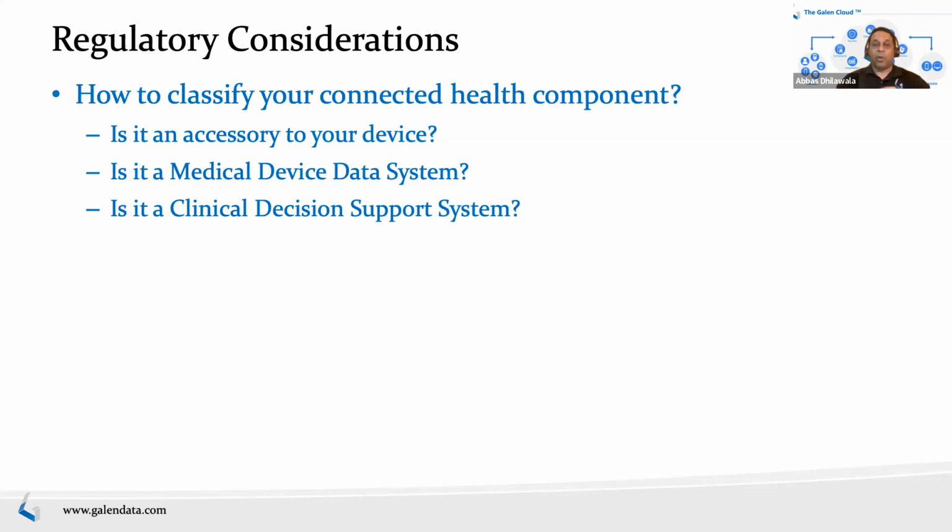Again, this is a regulatory question. I'm not going to go super deep into this, but these are questions you need to ask your regulatory people, and how do you deal with that? And that's why your ROI sometimes can come into play. Do you do it now upfront? Do you do it later once your device is approved? And what are the ramifications for those things? As I said, your digital component might not even be a device, not even fall under any kind of regulation. Unlikely, but that's possible. Again, something for regulatory people to think about. But these are questions you should ask if you're considering any sort of connected health component.